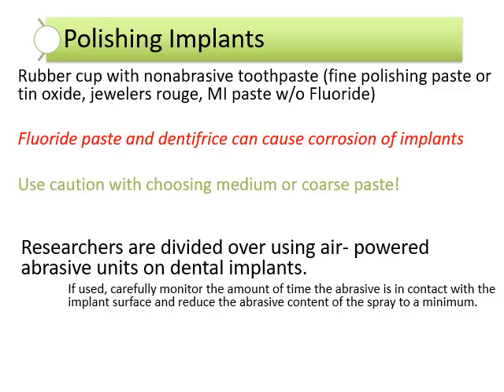Again, this slide covers information found in textbooks regarding polishing implants. People use fluoridated toothpaste, rinses, etc. at home. Our Prophy paste has fluoride in it. It happens. I use Prophy paste on implants.